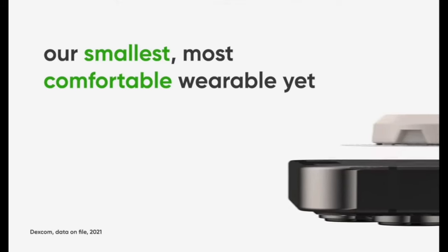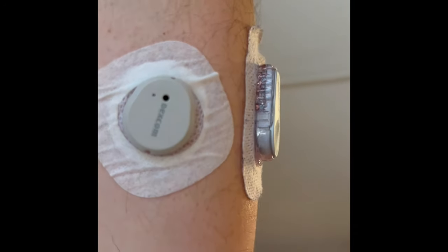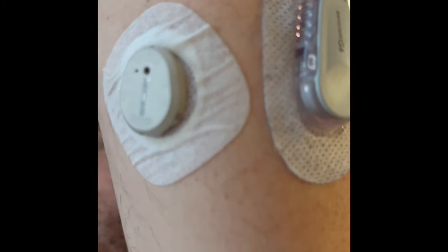Now let's go back to size — we talked about the box and applicator, but let's talk about the sensor itself, which was promised to be much, much smaller. Dexcom said it's supposed to be 60% smaller than its predecessor. It's hard to tell because the overpatch makes it seem larger, but in actuality it is much, much smaller. The thing I appreciated most was just how thin it was, how flush it was to the skin. It really didn't stick out much at all compared to the Dexcom G6.